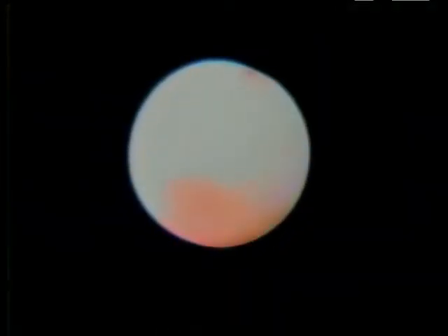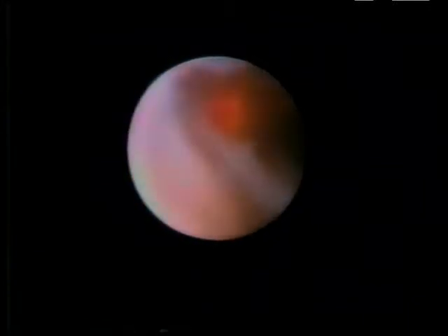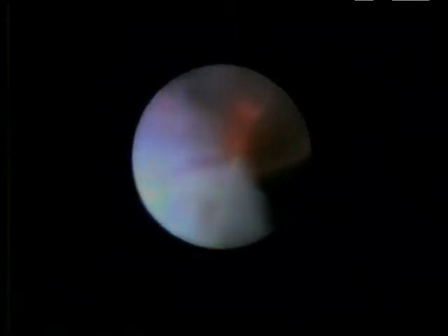An incision was made posterolaterally with a Holmium laser through a small diameter rigid ureteroscope. For this procedure, the laser was set at 1.2 joules and 15 hertz. A very sharp incision could then be made through the entire thickness of the wall of the ureter. The remaining fibrous bands could be visualized endoscopically and incised further. A double pigtail stent was left in place at the end of the procedure and remained indwelling for several weeks.